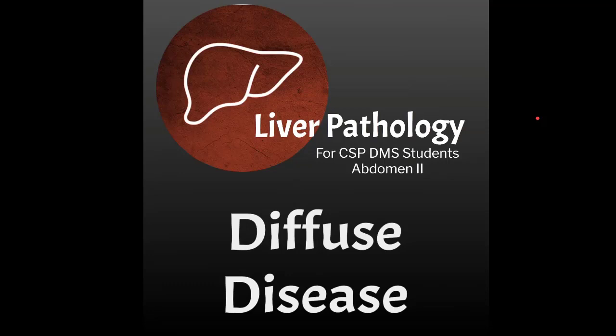In our lessons, we'll be looking at pathology of the abdominal organs and how they are viewed on ultrasound. Today's lesson is the first in a 5-part series regarding liver pathology. Let's go ahead and get started then on diffuse disease.